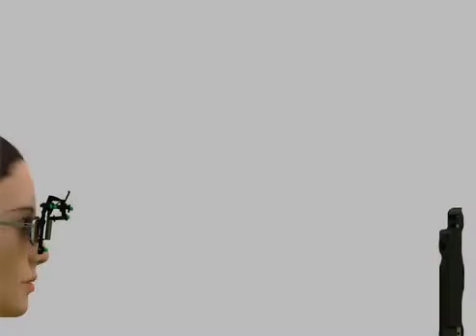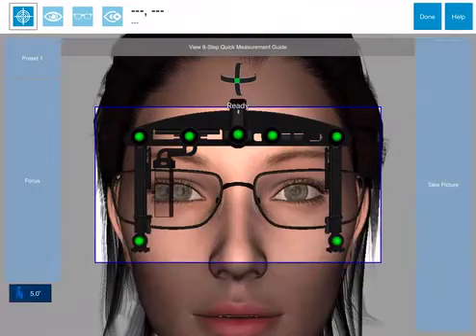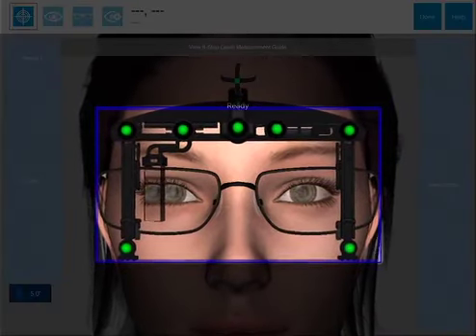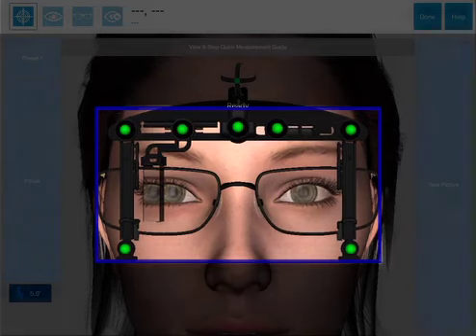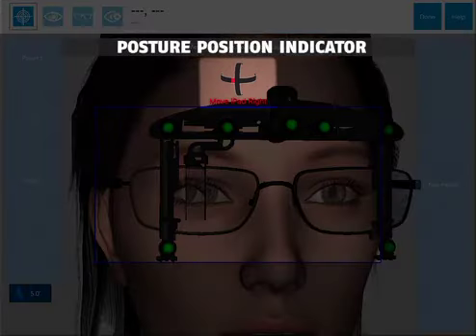When taking the measurement image, position the iPad at approximately 1.5 feet or 45 centimeters from the customer, where the green OPD sensors will take up most space inside of the blue rectangle. The customer's captured posture is recreated by following the on-screen position indicator until it reads ready.